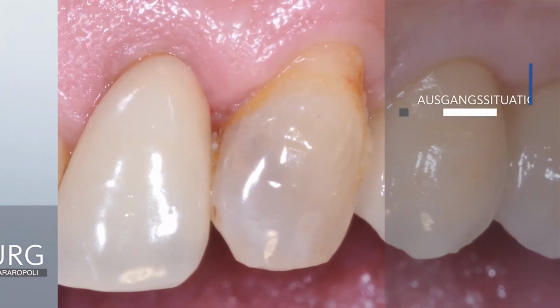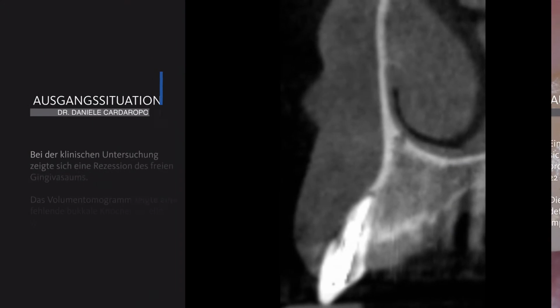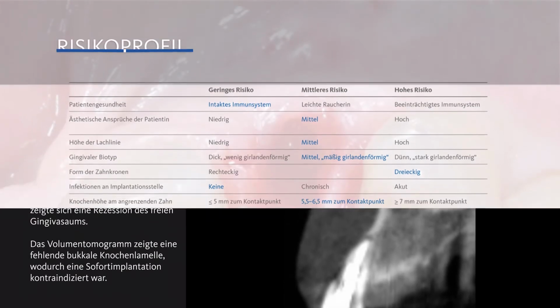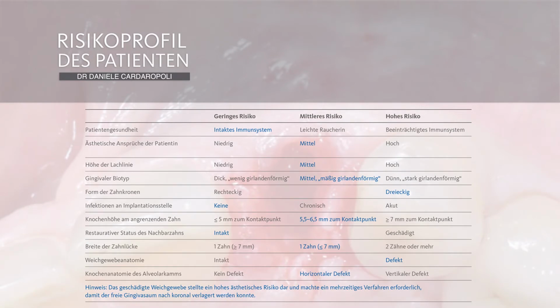We have an endodontic and prosthetic failure on this upper lateral incisor with gingival recession of the free gingival margin, together with the buccal bone that is missing, as we can see from the cone beam evaluation. From the point of view of the risk profile, we see that the bone height at the adjacent tooth is between 5.5 and 6.5 millimeters. And we have a compromised soft tissue anatomy due to the gingival recession with a horizontal bone defect.